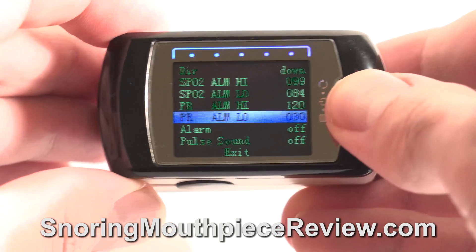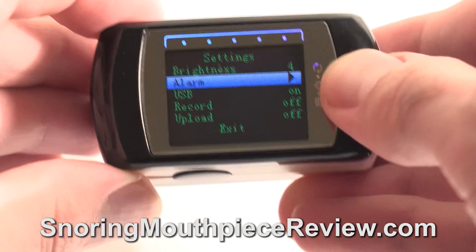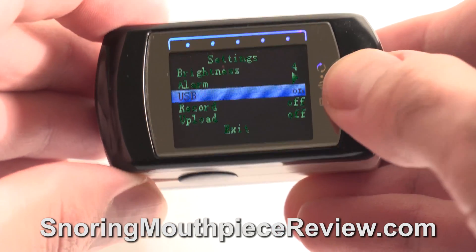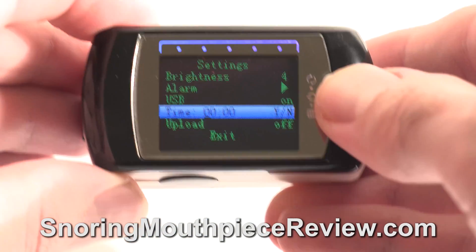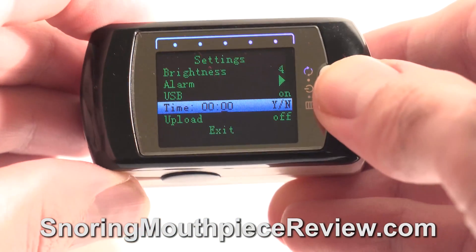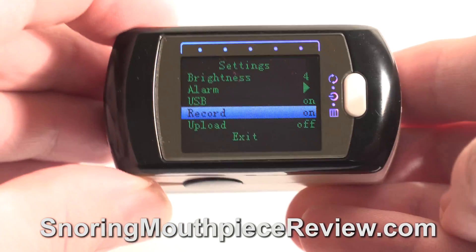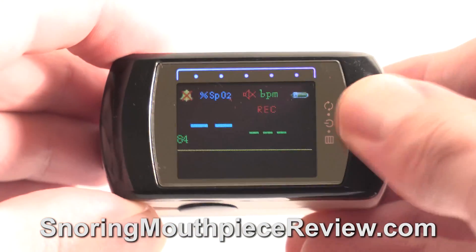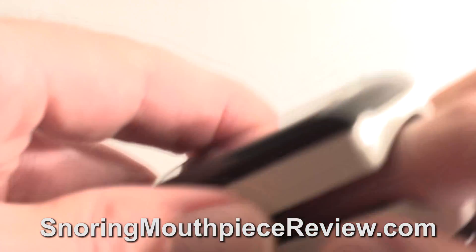You can set a pulse sound and an alarm sound here. To record your oxygen saturation and heart rate while you sleep, go to the record screen. Here you set the start time for when you go to sleep. Once you set the start time, press the button until it is on the letter Y, then hold it down to start recording. Exit the screen and you will notice the pulse oximeter is in record mode.